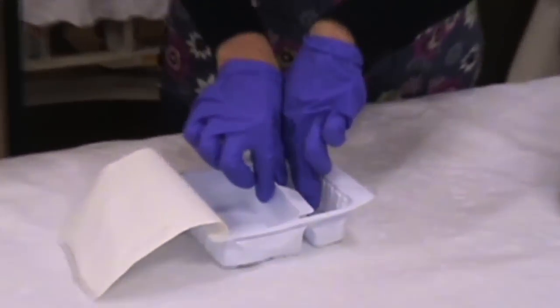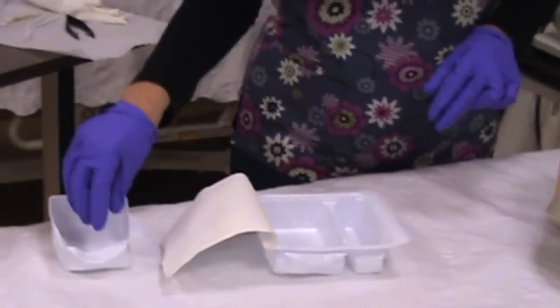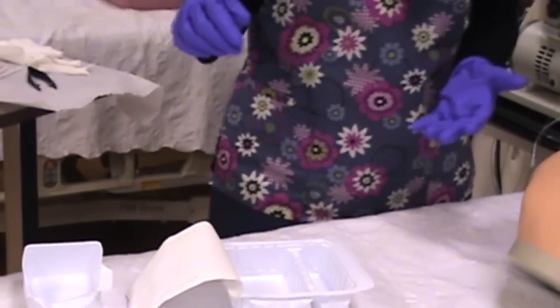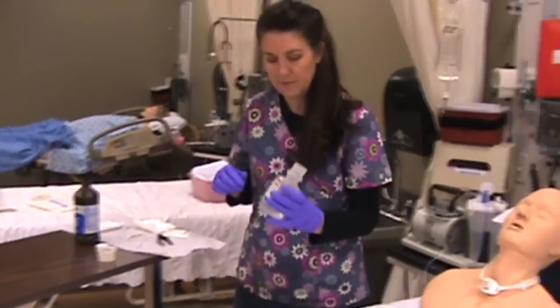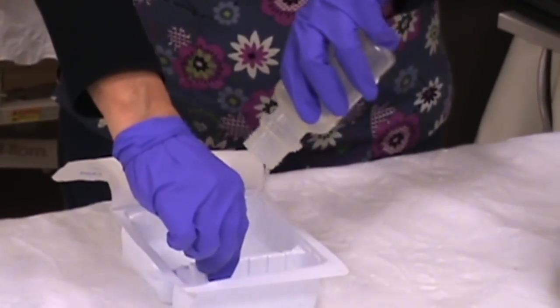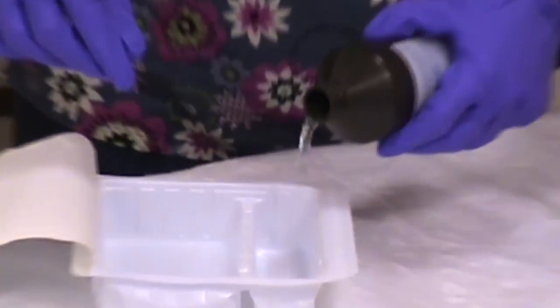If you look carefully, I can touch the inside of this because my gloves are sterile, so I'm going to make this into my little trash can. I can lift this on the inside, but if I touch it on the outside, that contaminates it. Now I'm going to establish a non-sterile hand — my left hand — and I'm going to get some water and pour it right here. You don't want to go over your sterile field at all, so I'll go around it. And then there is your hydrogen peroxide.